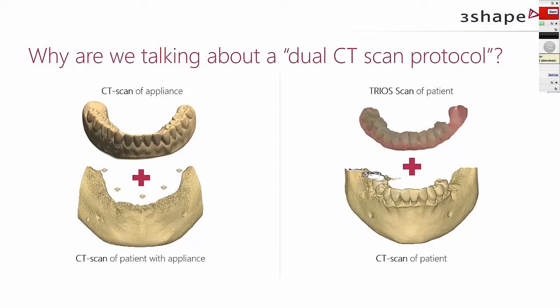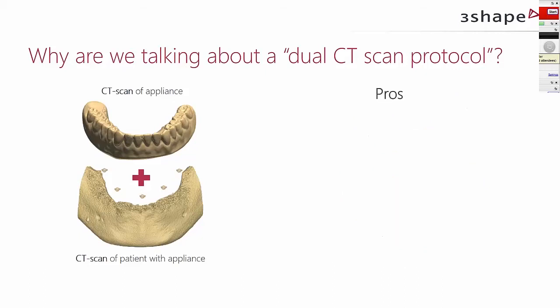Yeah, and before we move into that, I just quickly want to mention that the dual scan protocol is not something that we have come up with. It has become the golden standard for guided or computer-guided implantology for edentulous cases, which is also very much what we use it for. And that leads us into the pros and cons. I don't think we should spend a whole lot of time on it here and now, because we want to move on to the practical side of things. But the pros and cons depend a little bit on who you are and how you're used to working.